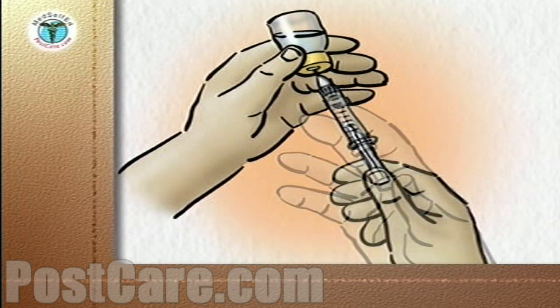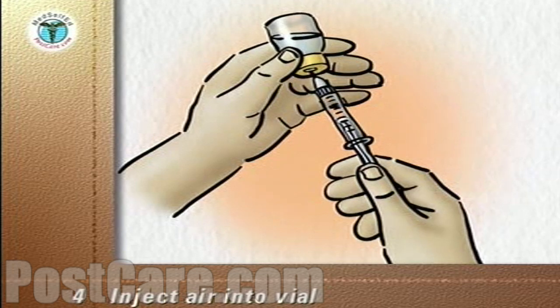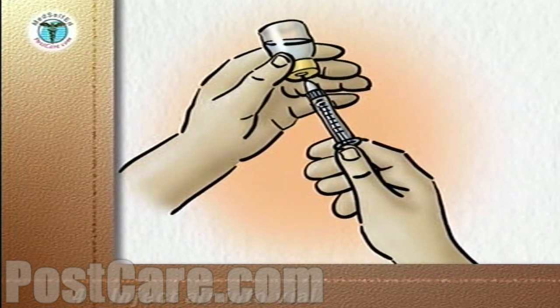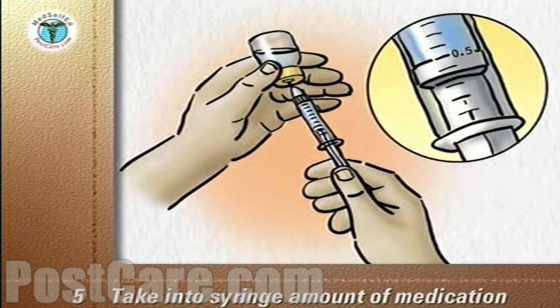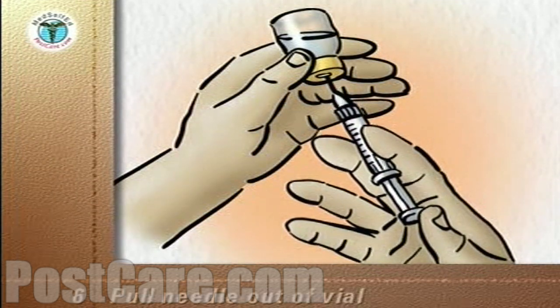Keep the tip of the needle below the level of the medication in the vial. Depress the plunger to inject the air into the vial. Slowly pull down on the plunger to draw into the syringe the amount of medication prescribed for you. Then pull the needle out of the vial.